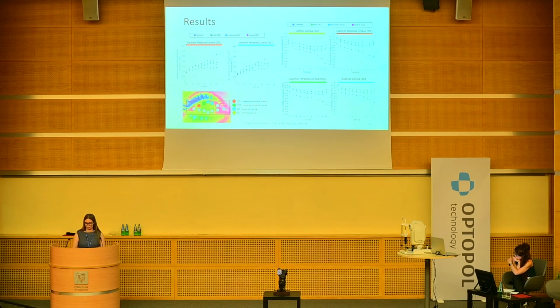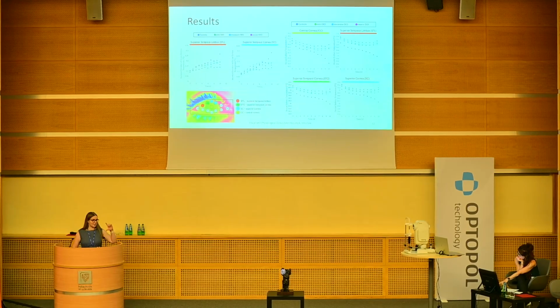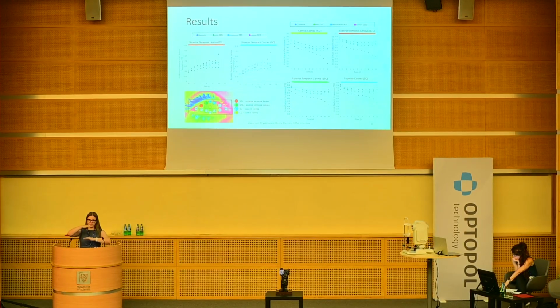They were behaving temporally, and we saw that the average temperature, of course, drops in time, but what is even more important, the standard deviation in those small areas was expanding in time as well. And this was actually seen as a better version of what is happening with the tear film. So not only the average ocular surface temperature, but the standard deviation of the temperature: when the tear film breaks, it increases the standard deviation of the temperature.